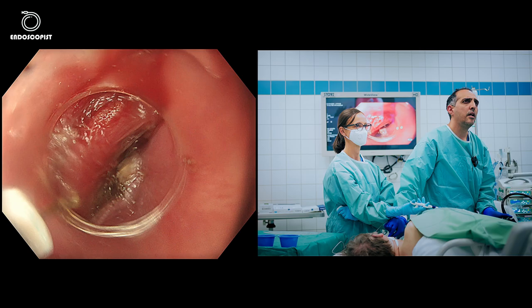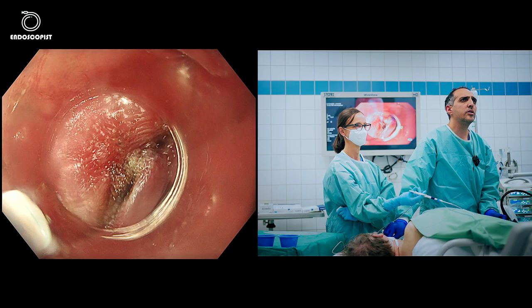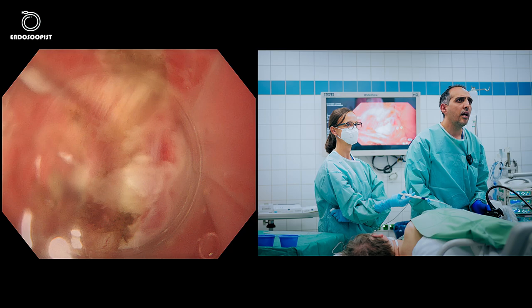I think we are finished with tunneling and will now start cutting the muscle layer. We tunneled on the diverticulum side and then on the lumen side. I can see some bleeding, so I'll stop this first with coagulation. Stopped.